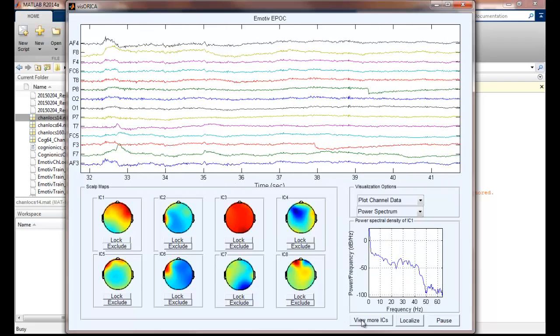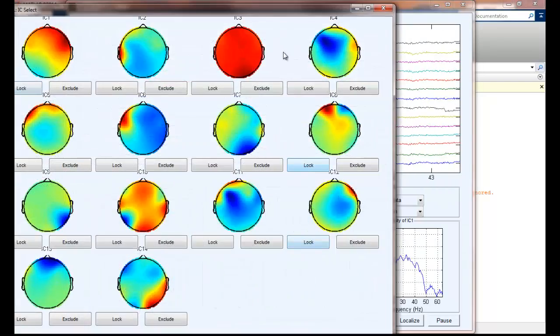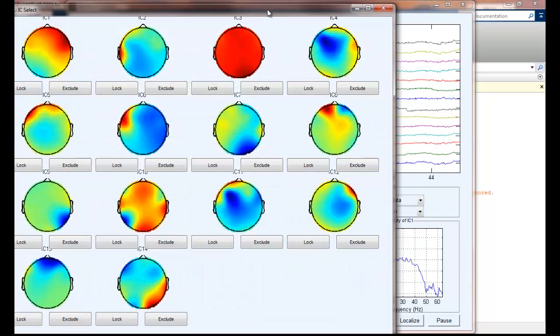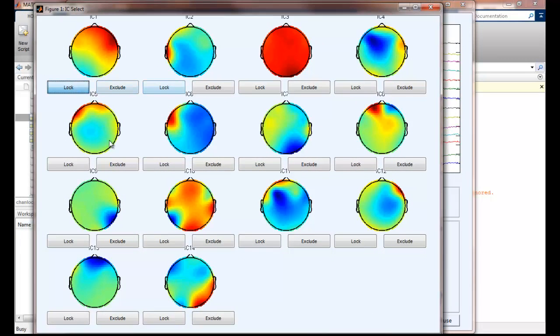To see all the independent components, we can click view more ICs here. It will pop up a window. We can lock the ICs of interest onto the main interface.